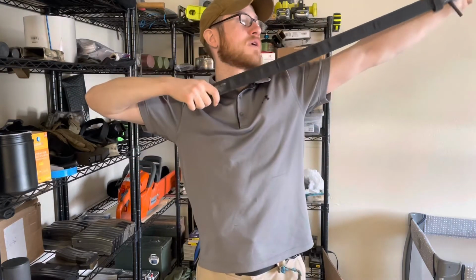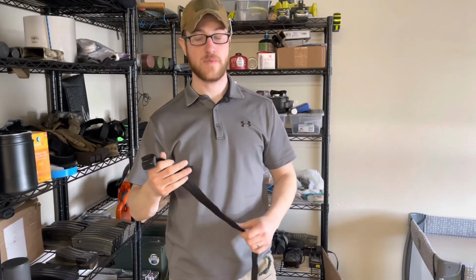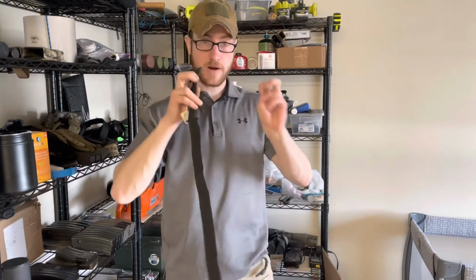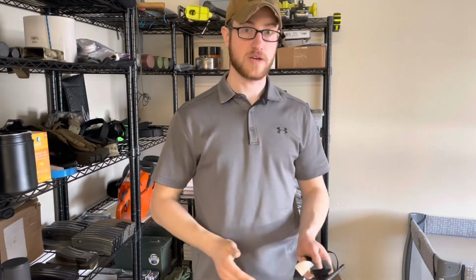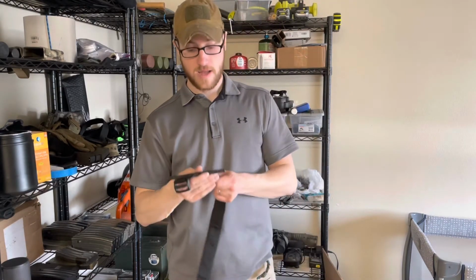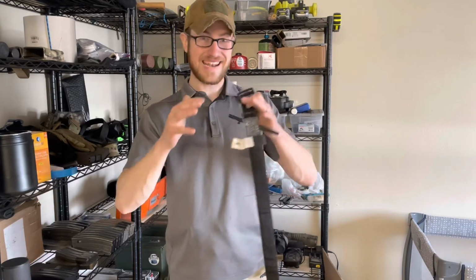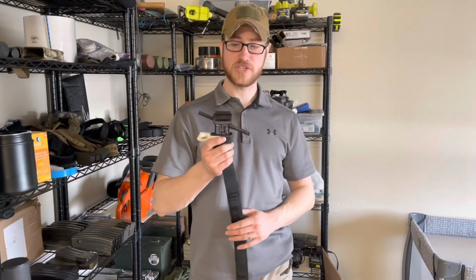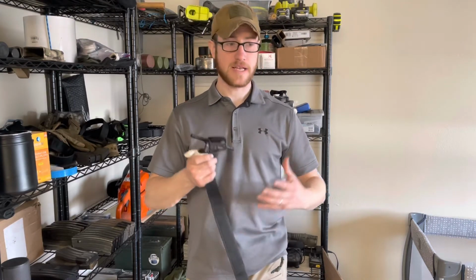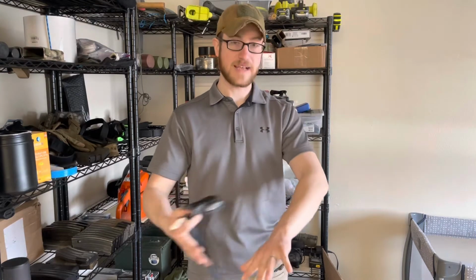Combat casualty care is broken down into 3 phases. You have care under fire, tactical field care, and then casualty evacuation. Care under fire is the care that you render to the patient literally under fire, whether you're behind cover or not. Tourniquets are the only intervention you're going to do in that phase of TCCC. So the reason they teach high and tight tourniquet placement is because in that moment you see blood coming out the bottom of the arm, or you see massive bleeding.